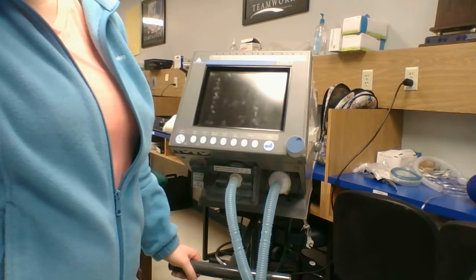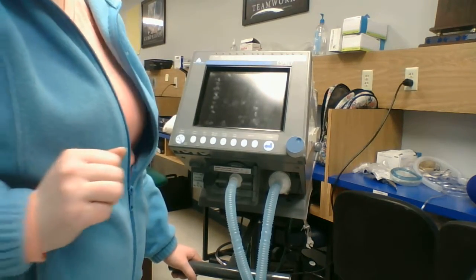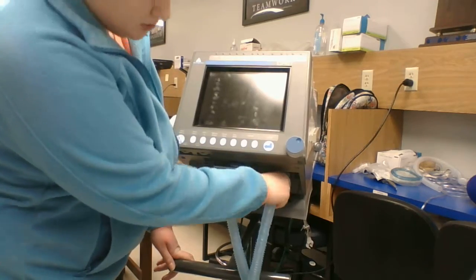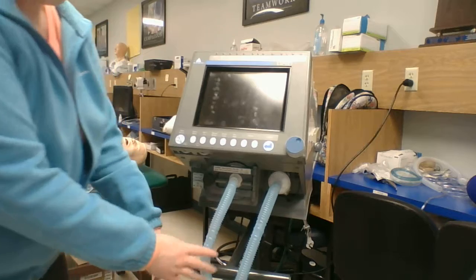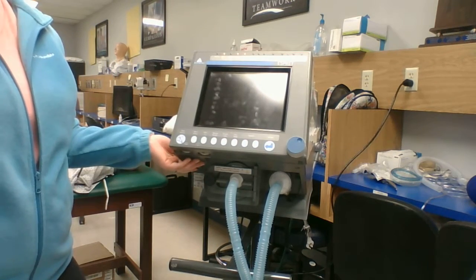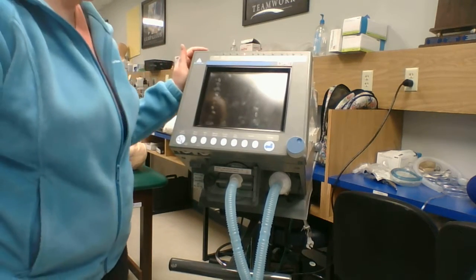Hey everybody, so I'm going to go for my ventilator. I already have it hooked up. This is my inspiratory limb and I have my filter on it. This is the expiratory limb. It's all hooked up to my patient. I'm going to turn it on.